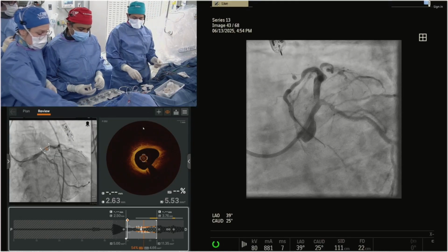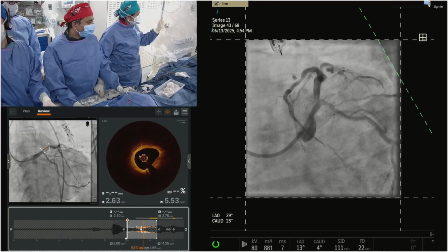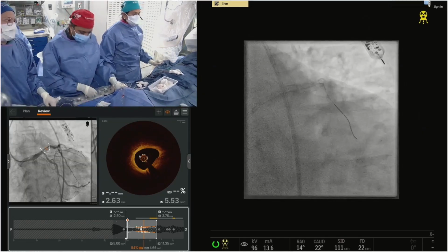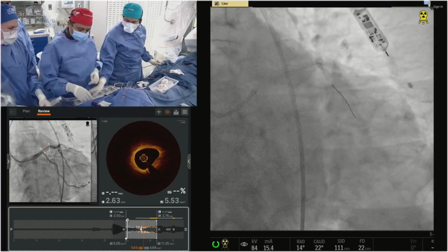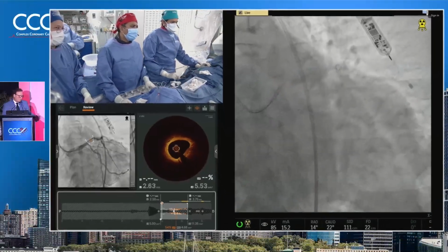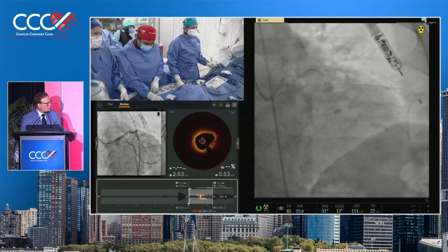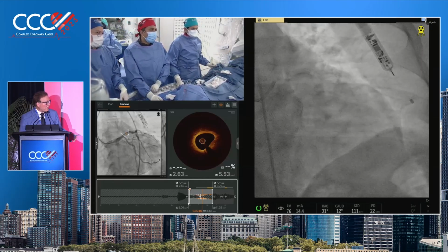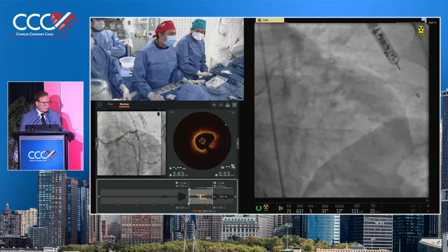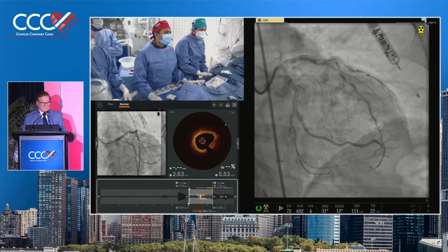Forget it. Okay, nobody. Kiski, Dr. Marina, you're alone. How often do you see calcific neoatherosclerosis versus soft plaque with neoatherosclerosis? Often. We see a lot of calcium behind the stent too, and within the stent. For neo, is near infrared the way to go? OCT can give you some idea, but in order to diagnose neo, you do near infrared, and we have a publication with Kinney in Circulation about that. But usually it's not calcified though, right?